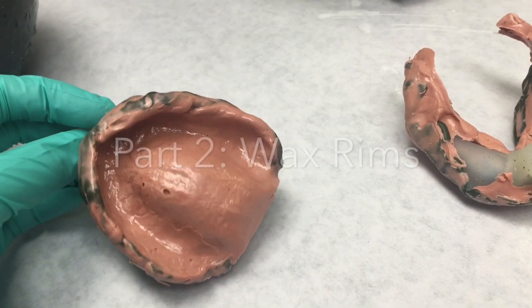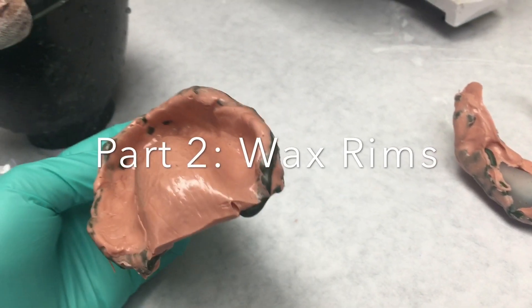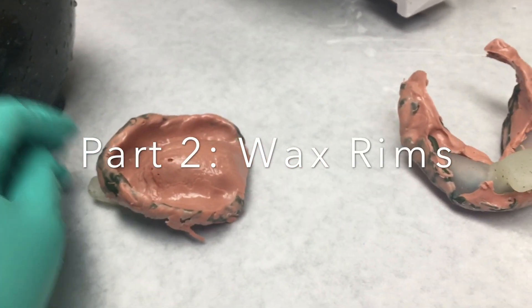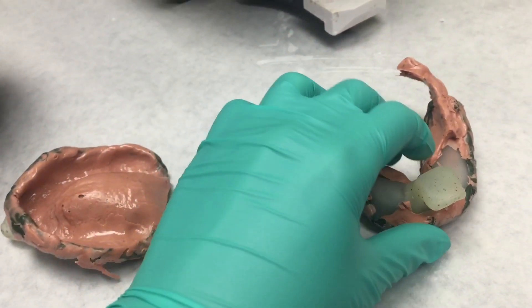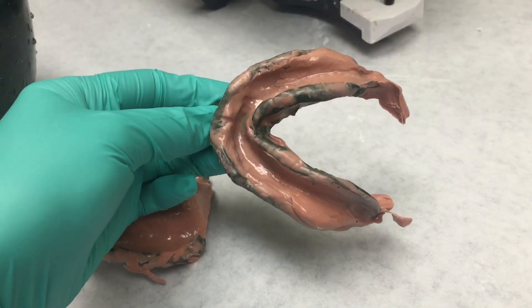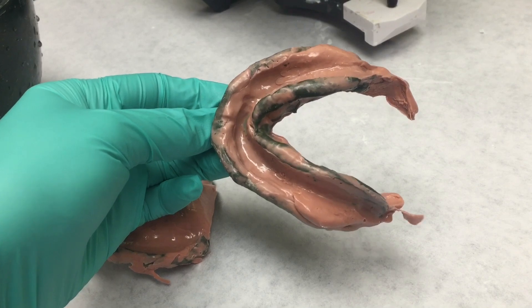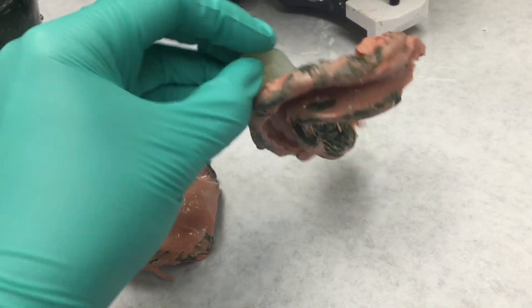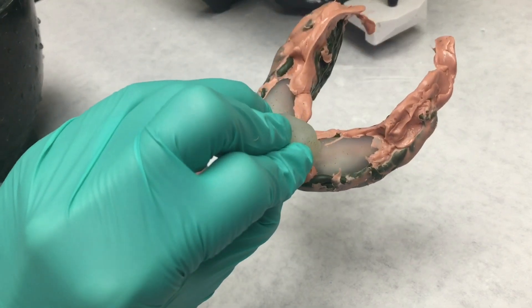I have here the custom trays which I already put the border modeling on, and I was able to capture the spaces and the borders of the patient's mouth. Then I used PVS, so this is already custom to the patient. The point of this is to get the borders so the denture fits a lot better.